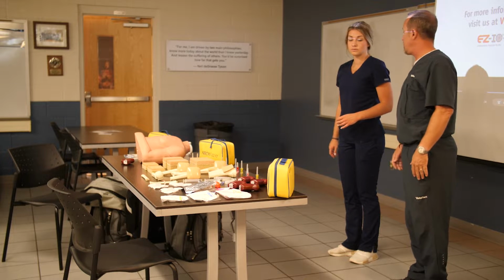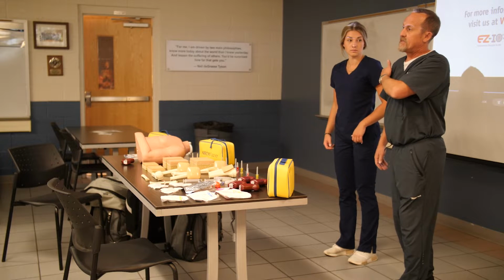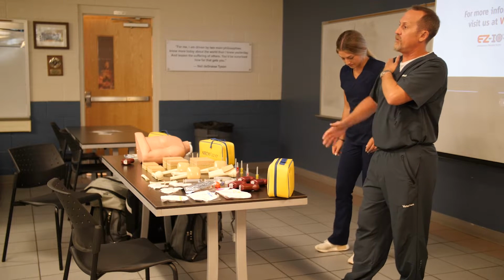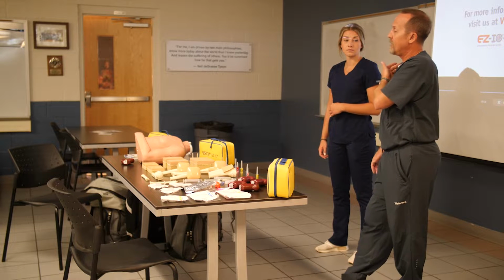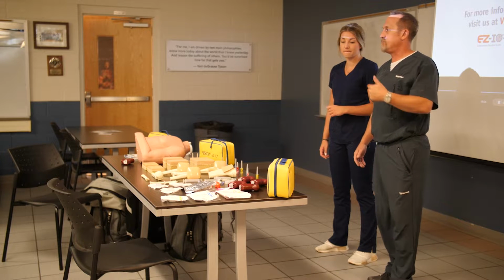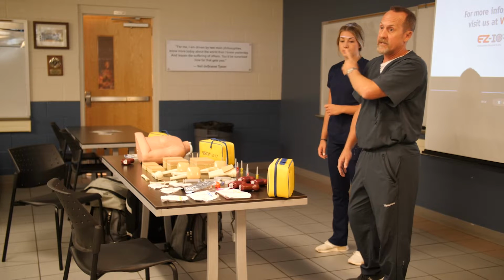So what we want to do, most importantly, with the proximal humerus, we have a biceps tendon that's in here, and as you move your arm around, that bicep tendon kind of floats around over the humeral head. So the risk of that is, it doesn't really matter if you stick the needle through that, but if the arm moves around, it's going to try to eject the needle.